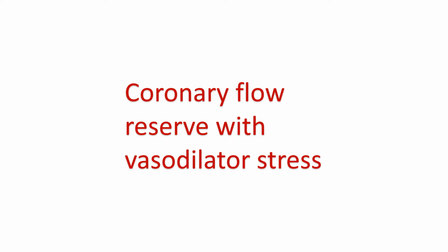While the ultrasound beam replenishes in 5 seconds with normal resting flow, it can replenish in 1 second if the maximal hyperemic flow achieved by vasodilator is 5 times normal. So the 5-second rest images would look like the 1-second stress image. Regional changes indicate reduced coronary flow reserve due to coronary artery disease. If the finding is global, it indicates reduced flow reserve due to systemic conditions like hypertension, diabetes mellitus, or dyslipidemia.